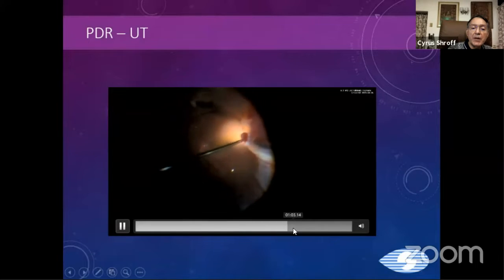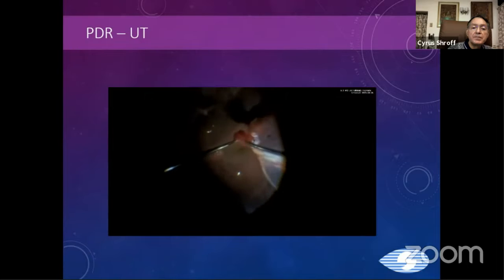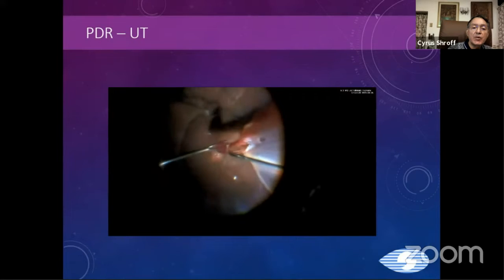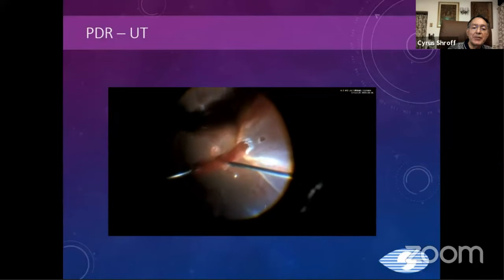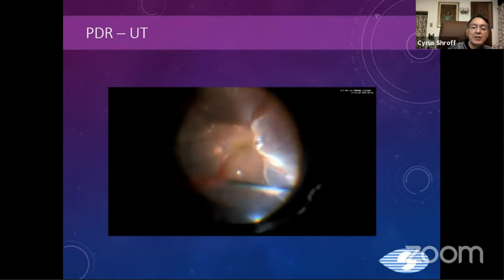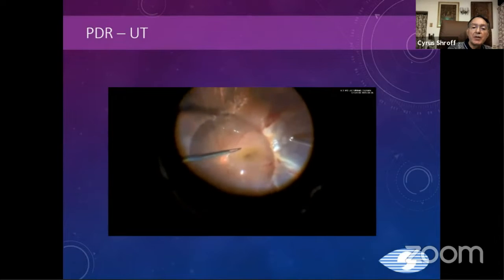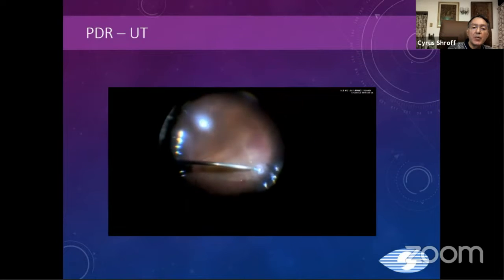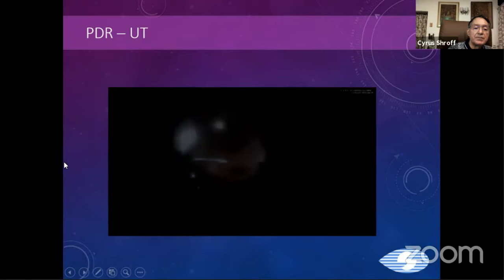And then finally, we removed this clot bimanually. It was tending to spring back. So again, with the same hand-on-hand maneuver as we had used for the subretinal band, we removed this rather large subretinal clot. And once that was removed, the retina looked a lot better and more mobile. And then with the usual fluid air exchange, we used gas in this case.